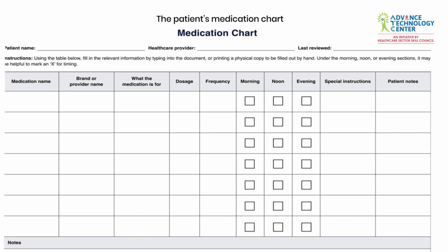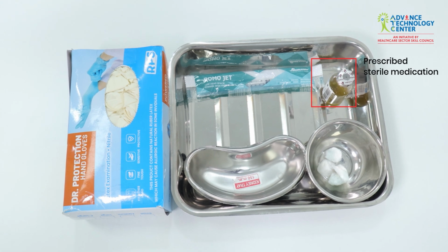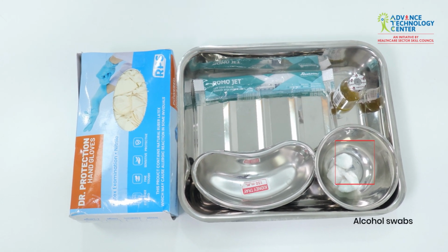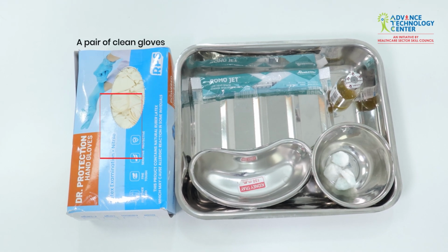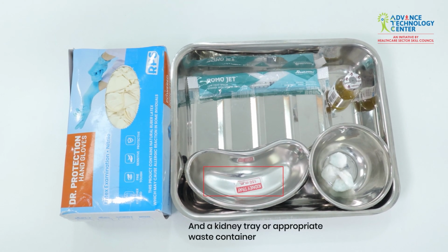Equipment preparation. Let's prepare the tray. You will need the patient's medication chart, prescribed sterile medication, a 1 milliliter tuberculin syringe, alcohol swabs, a pair of clean gloves, and a kidney tray or appropriate waste container.